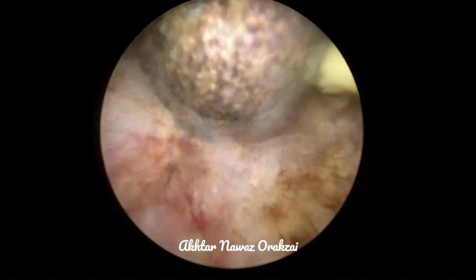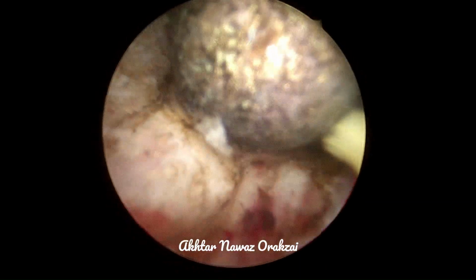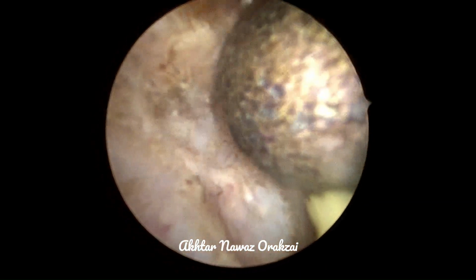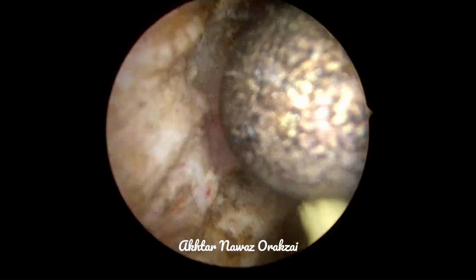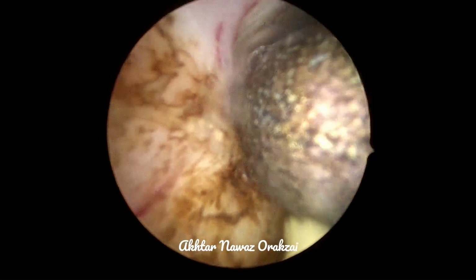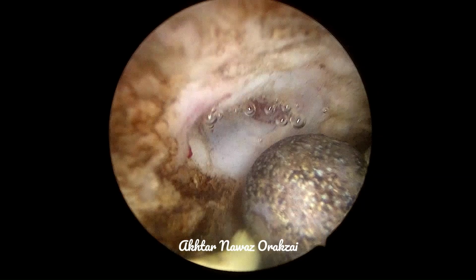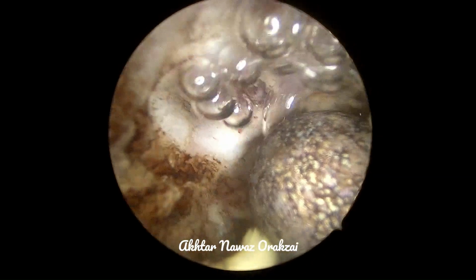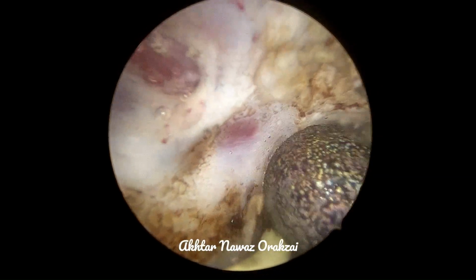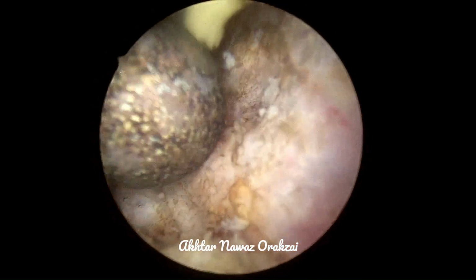So I have coagulated all around that breach in the capsule instead of going into the center of that cavity. The same is the case on the right side. This is the breach in the capsule, so I'm coagulating the edges of it, which may bleed, and I'm using minimum cautery in the center of that breach.